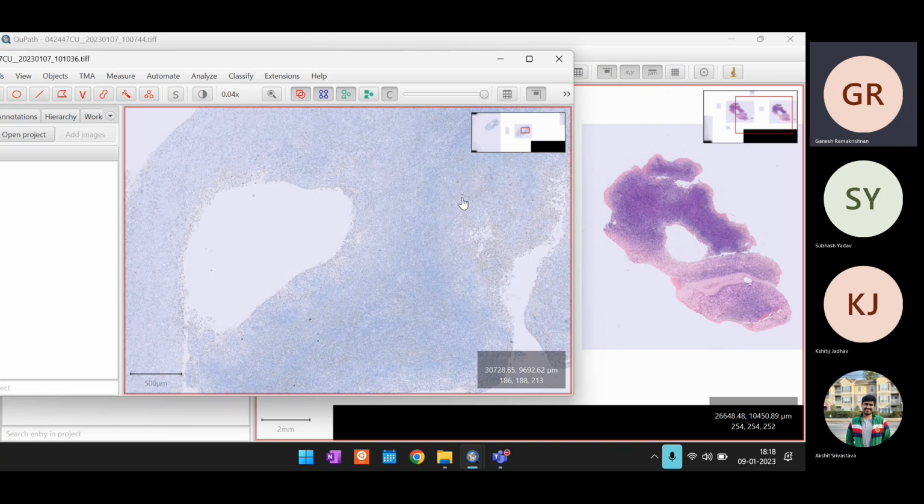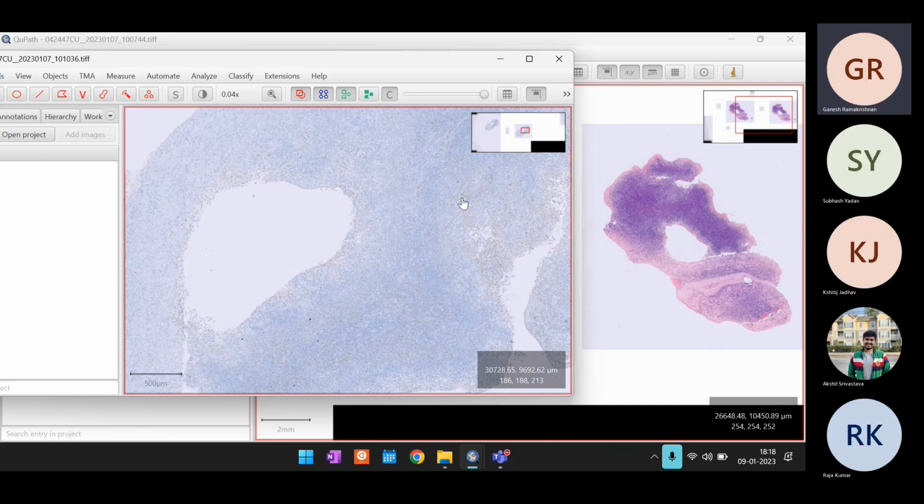Yes, right. But you want to go beyond the cells to also look at different microenvironments. And therefore, I'm saying we want a combination. We want targeted, and we also want a larger subset to be selected. Not just selected, but kind of clustered as well. That's the keyword Kshitij was using.